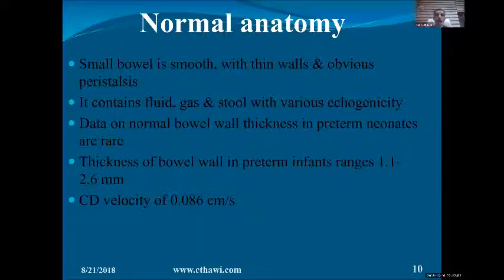You'll see green, you'll see yellow. And if you're doing trace, if it's positive, it will be cut from the positive and added to the negative. And if it's in the negative, it will be cut from the negative and added to the positive side. That's what we call aliasing. To solve this, you widen your pulse Doppler or you switch to continuous Doppler.